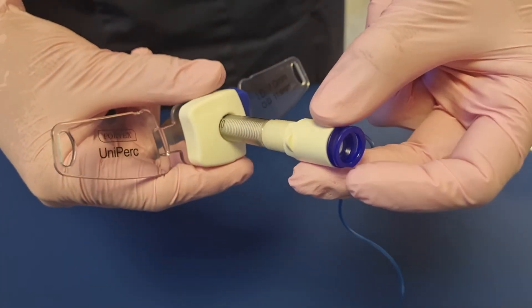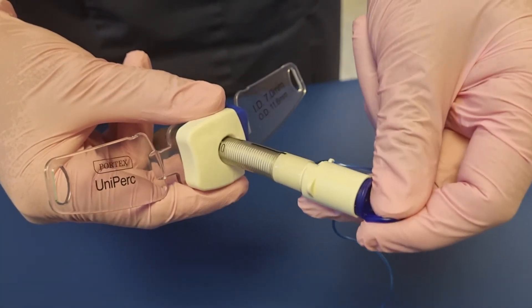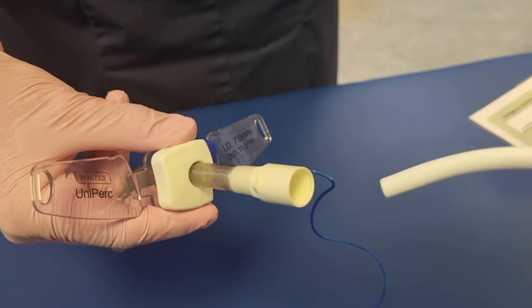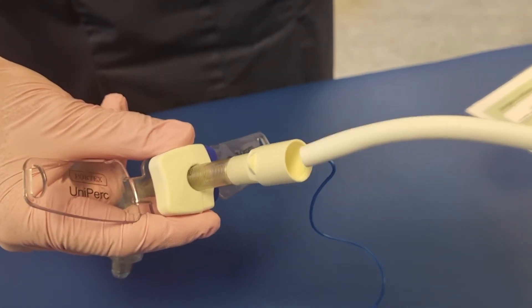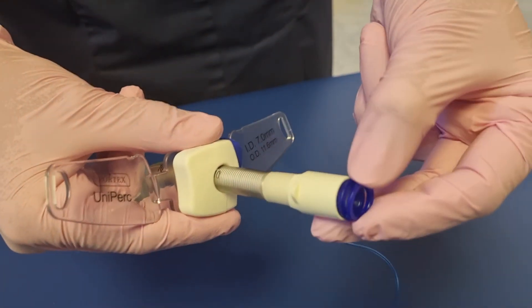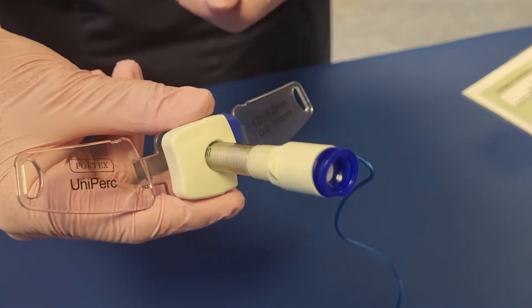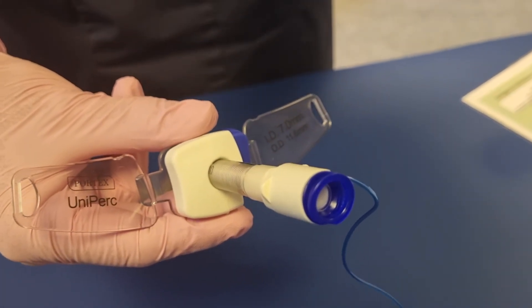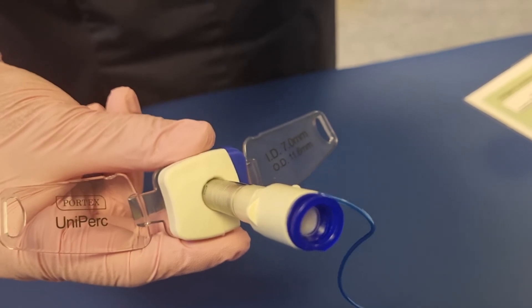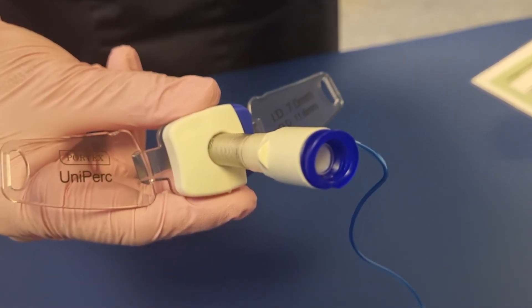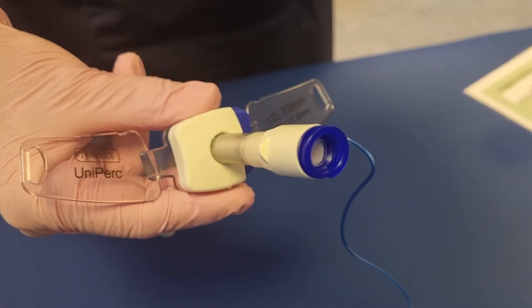Just to mention that this tracheostomy tube does also have an inner tube. So please ensure that when the patient comes back from theatre, this part of the tube is already inserted. We do have different sizes: 7, 8, and 9mm tubes, and all of them come with an inner tube.